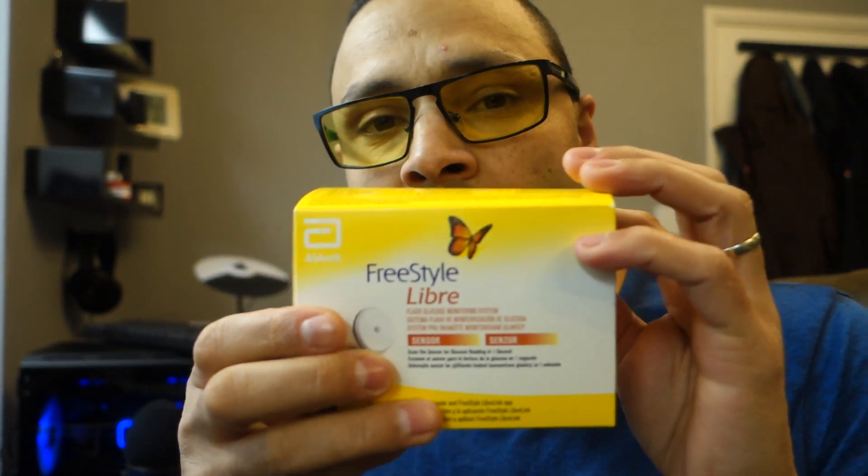Good evening. Today I wanted to show how I change the Freestyle Libre — this is it. I've been using it since 2014, that's about six years now, well on and off. I did use the G6 for a year or so.